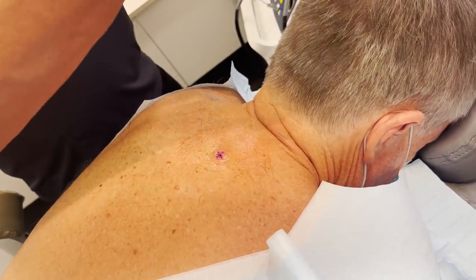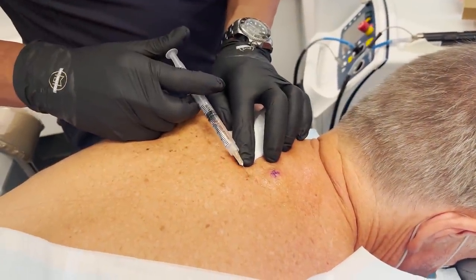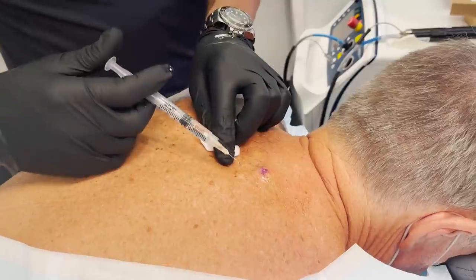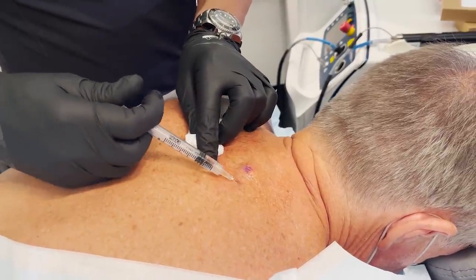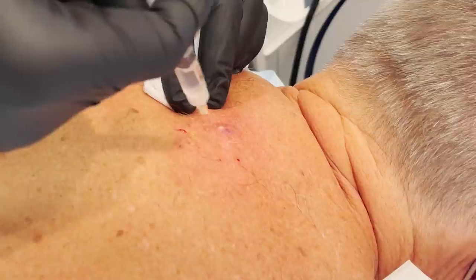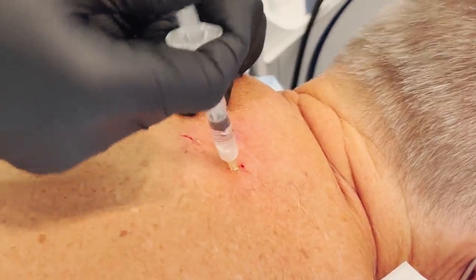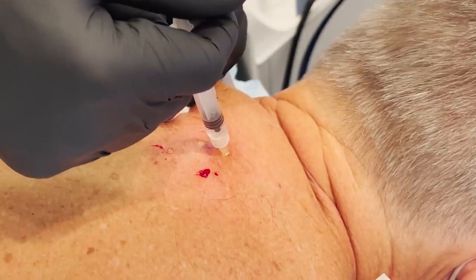Alright, here comes the worst part. A little pinch. One, two, three — ouch. Sorry. You okay? So you're going to feel some pulling. You might feel some pressure and that sort of stuff. You shouldn't feel anything sharp or painful. If you do, just let me know. I can always put more anesthesia in.